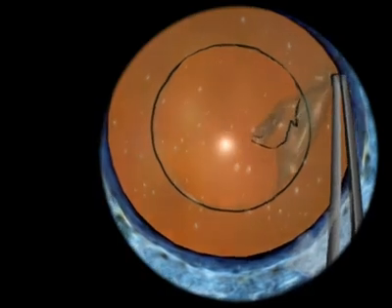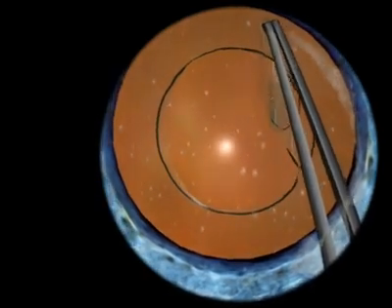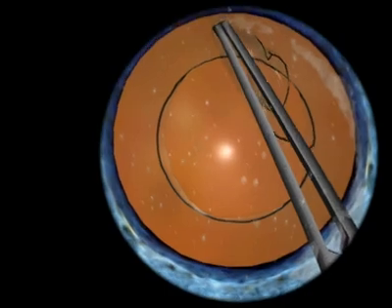Right here, I'm getting into the cornea. I just rubbed against the cornea a little bit. You can see it whitening there, and I'm getting some points counted against me for that.